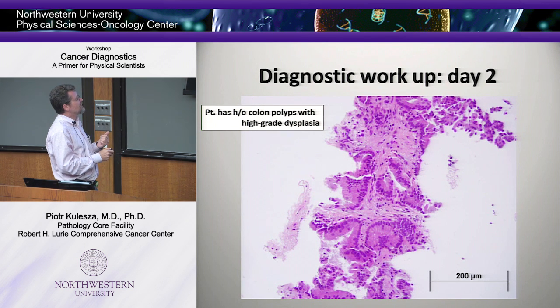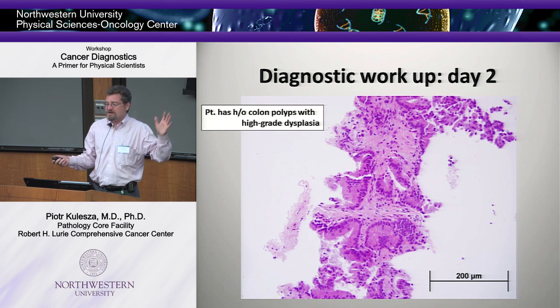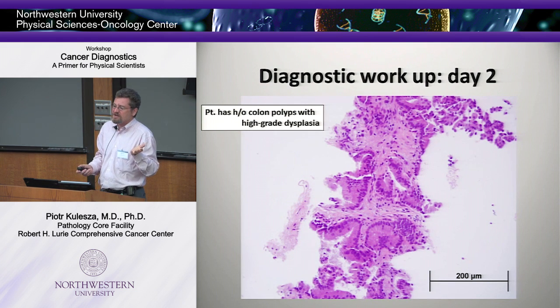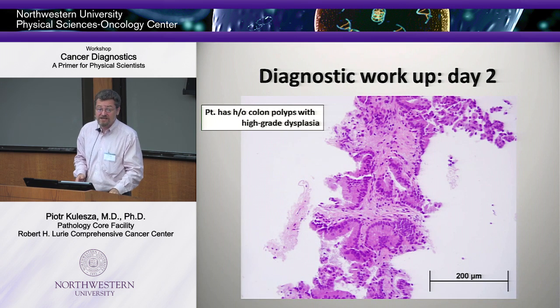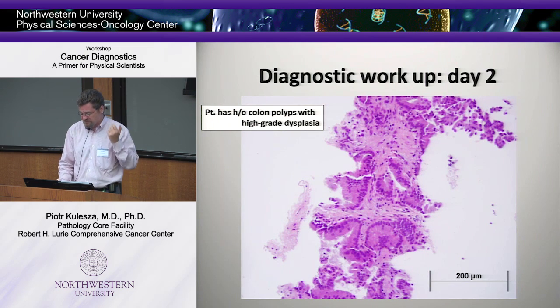Look at the red here and at the blue here. This is called palisading. These cells are polarized towards this end, and they are making their cytoplasm stick out. Same here, right? This is a feature of colon cancer. So now, based on my morphology, based on that whole pattern recognition of signet ring, mucinous, non-mucinous, I'm in a box, because my differential diagnosis tells me I cannot really say to Dr. Licht that this is a primary lung cancer. I have to figure this out, because it could be a metastatic colon cancer based on the morphologic characteristics of this specimen.